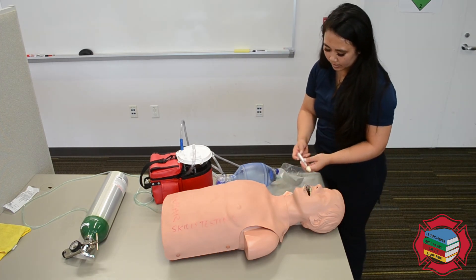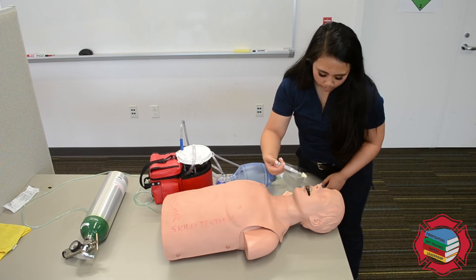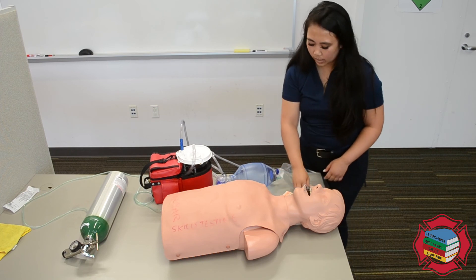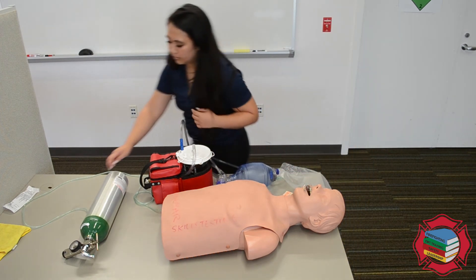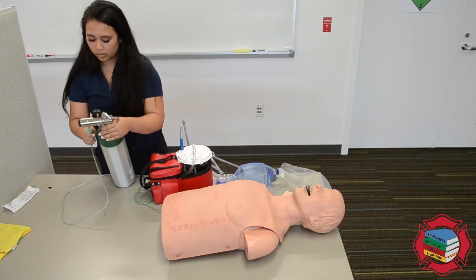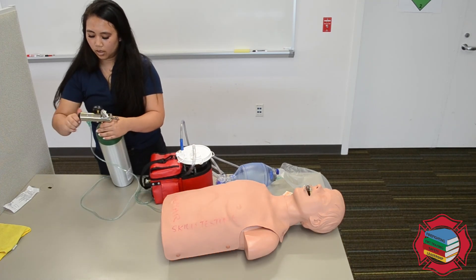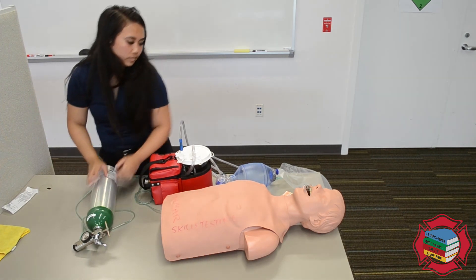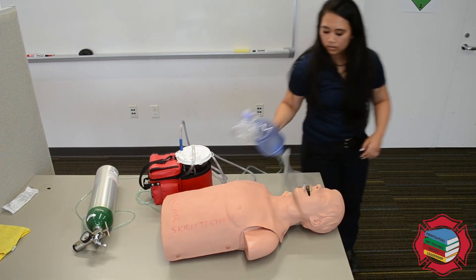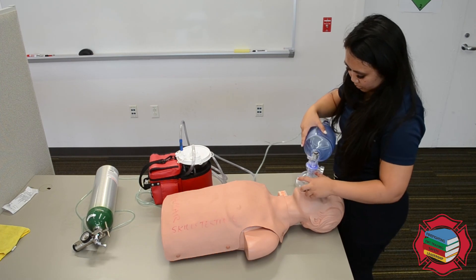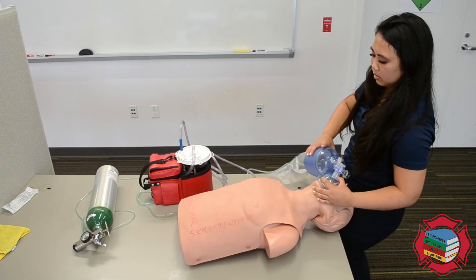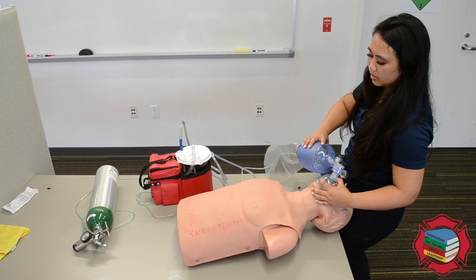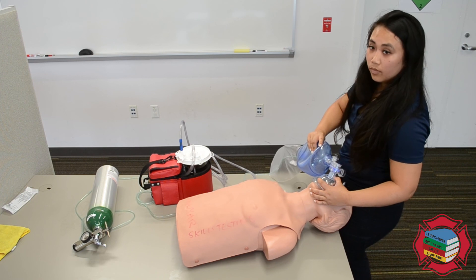Now I'm going to go ahead and administer one milligram in each nostril. Then I'm going to go ahead and continue ventilating my patient. I'm going to attach the BVM to oxygen at 15 liters per minute and then crack open the tank and continue ventilations.